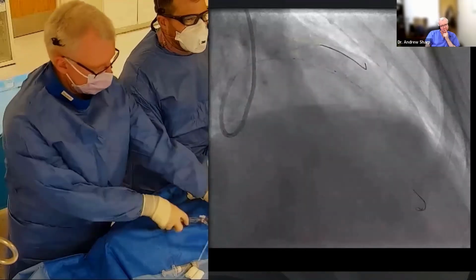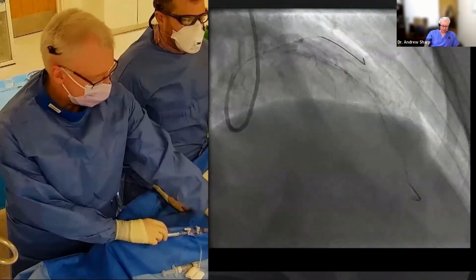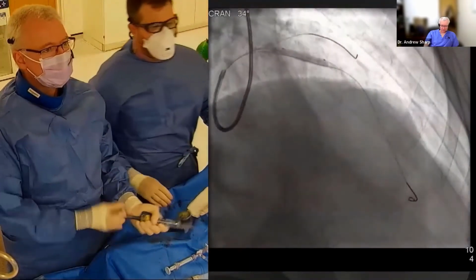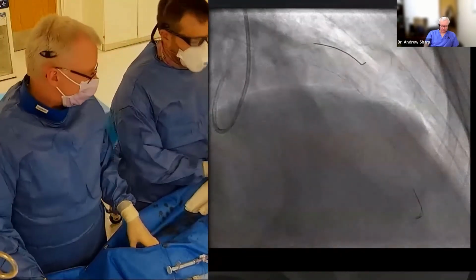Can I just come back? Little test there, because I just don't want to commit too far down the vessel. That's fine. Ectatic segment, don't we? Going up. Good. So I'm just at 10. Perfect. And that's gone up and released beautifully. Now, it'd be lovely to see if that's cracked, wouldn't it, on the IVUS? So shall we do that?